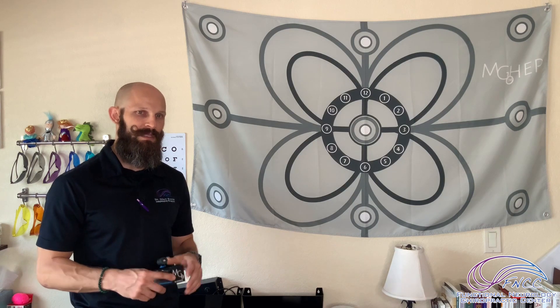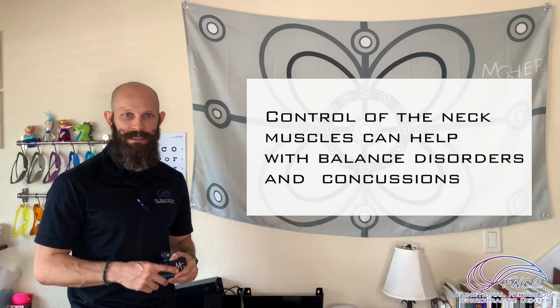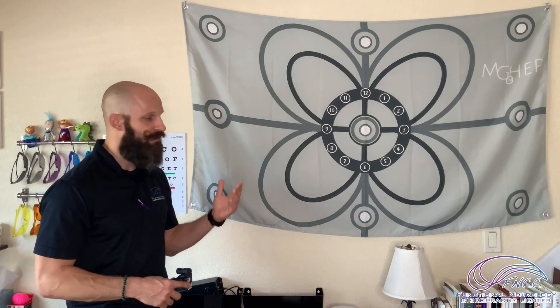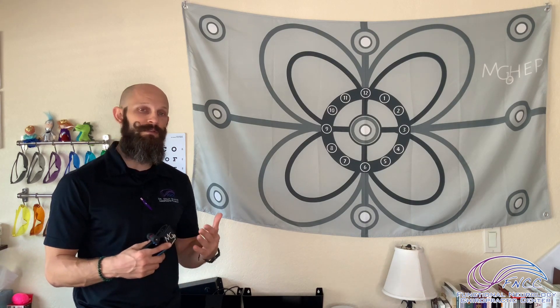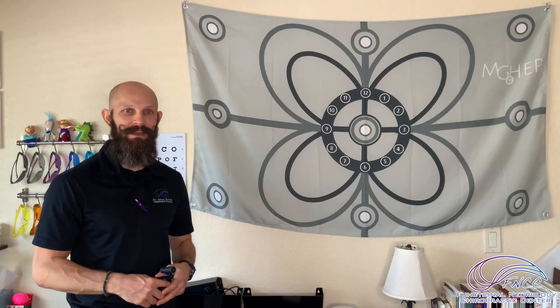There's been some really cool research showing that recalibrating and learning to control the neck muscles again can really help with balance disorders and concussions. This is just a fun little tool that we get to use at the office. We'll also have patients get systems like this at their home so they can do their own home exercises and get even more out of their recovery program.